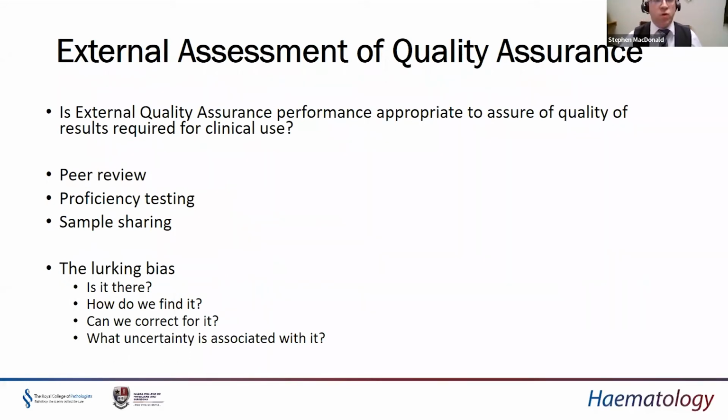To supplement that, we also use, which I'm sure is very familiar to everybody, external quality assurance. So whereas IQC picks up random variability and systematic variability in a system, external QA, as it's known, will tend to check how we are performing relative to our peers that are using similar analyzers and reagent combinations, and therefore can give us an indication as to what our systematic error or bias is across the population of people who are testing the same thing worldwide. It's extremely useful. It gives us a direct way of peer review. These terms are usually called proficiency testing.